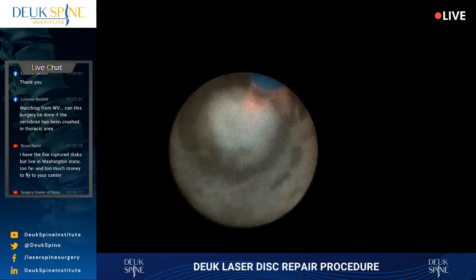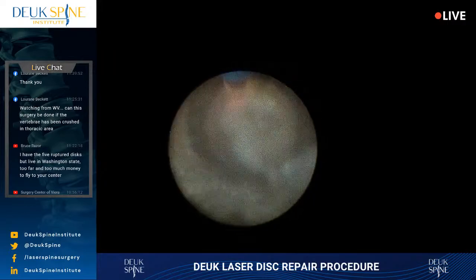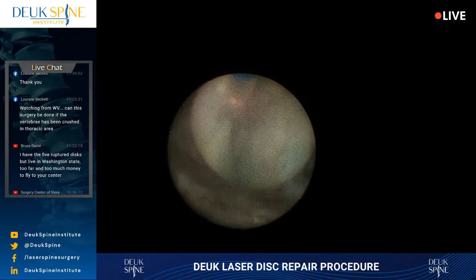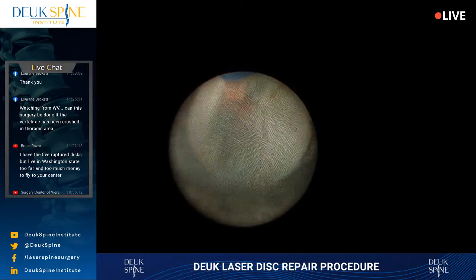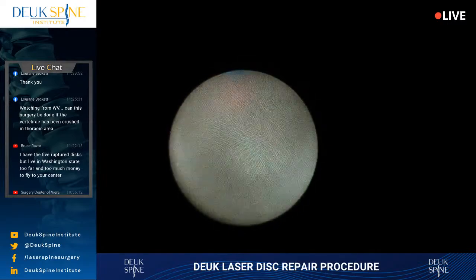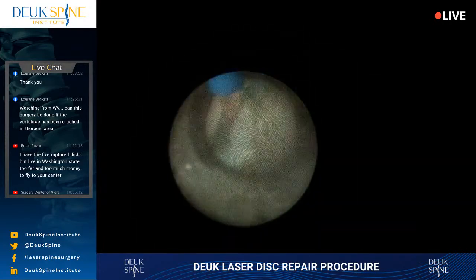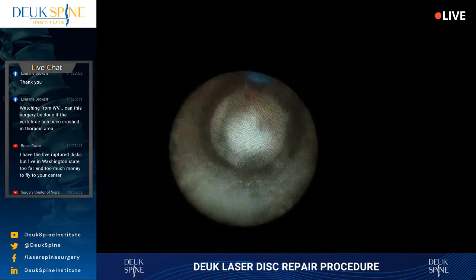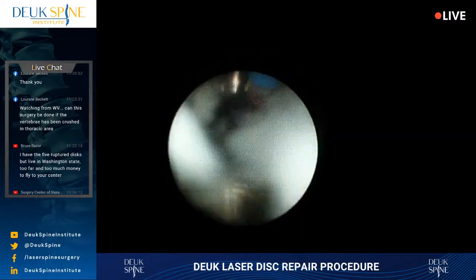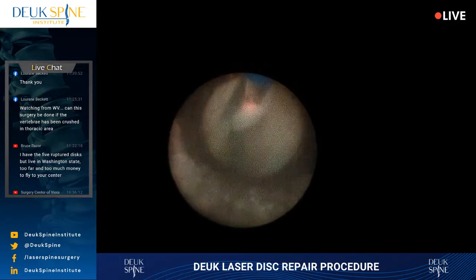Luis knows. Let's see if our audience knows the answer. Besides vaporization, what else does this laser do? Let's give our audience a few minutes and I will tell you. But you can actually see it right now if you're paying attention. I've mentioned it before. The engineer will appreciate it.